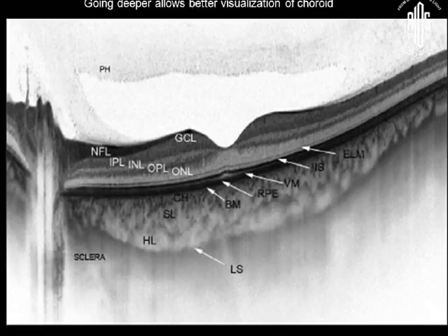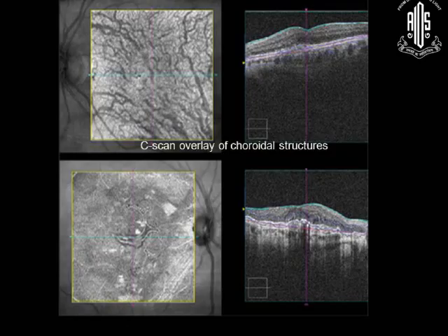This is what the en-face OCT of the choroid looks like, showing us the choriocapillaris. This is a patient with outer retinal tubulations. En-face has a distinct advantage: you put it on the fundus picture and you see that what you are seeing corresponds to what you are doing.